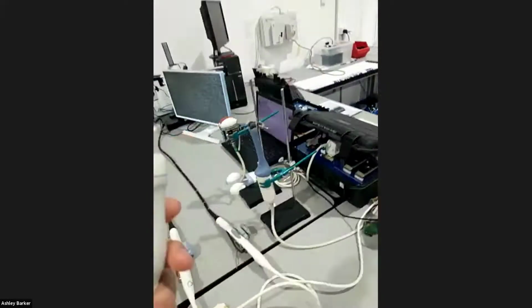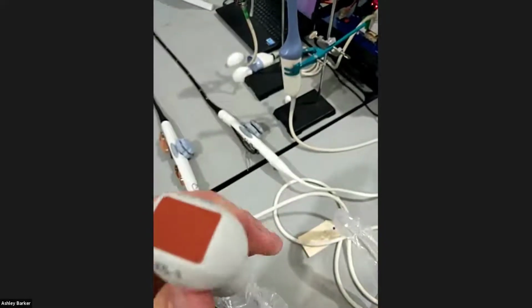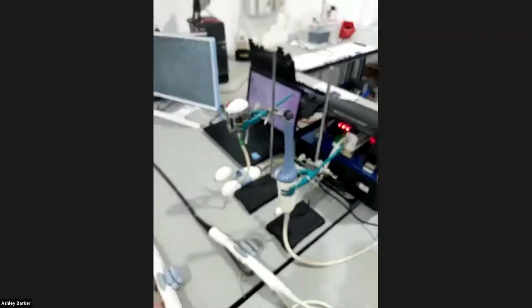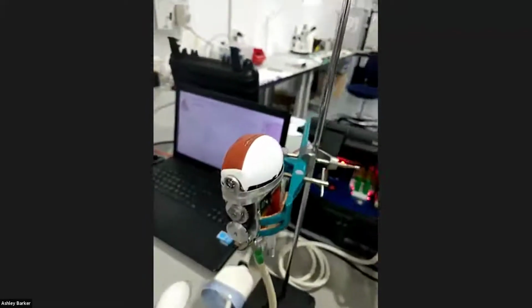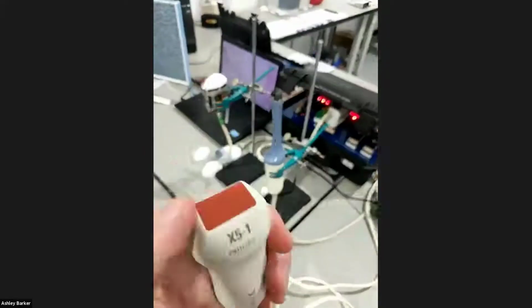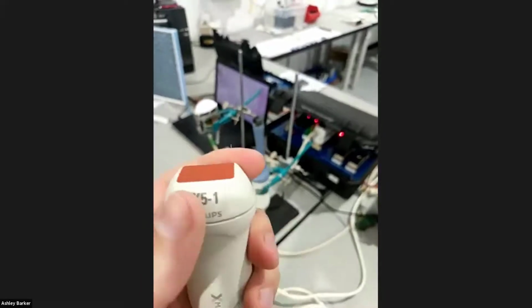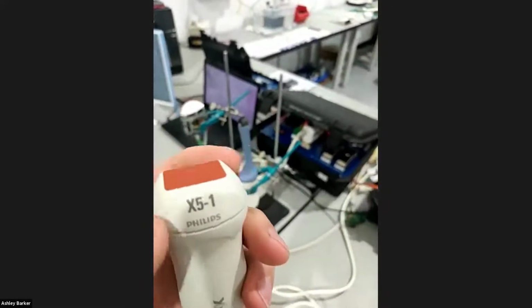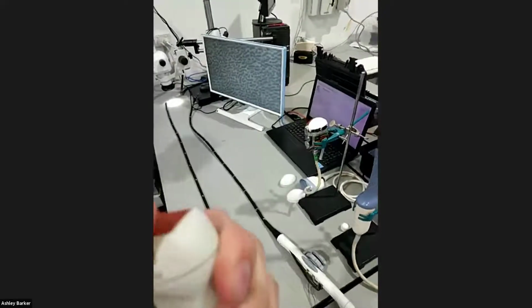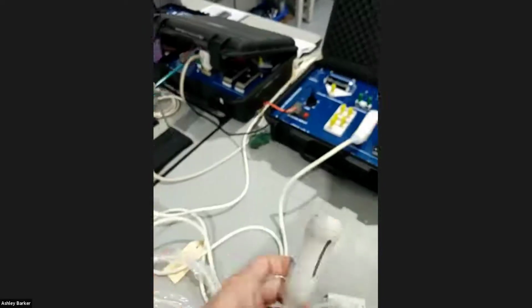The other one I wanted to show you, this is a Philips probe, an X5-1. So this is their 3D cardiac probe. And although it's a little bit different to this moving array baby probe, it's sort of the next generation of technology, if you like, because again, we can do full 3D pictures without needing to move arrays around. It's all just done electronically. And this has, I think, about 2,500 elements or something like that in the tip.